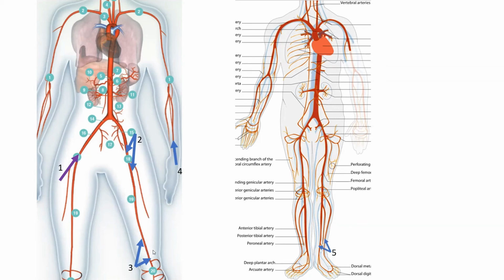But in the past, and it's still as of now, you could also use popliteal access instead of tibial access. People used to use a prone. They used to put the patient on his belly and stick the popliteal this way. But I recommend against it. By today's standard, we can do popliteal access in a supine position, stick the popliteal from the side with the knee a little frogged and raised, okay? But I'll explain it in another session. So the fourth access is the radial access, and the fifth access is the retrograde tibial access. Okay, so those are the 5 accesses, and you can combine several of them.